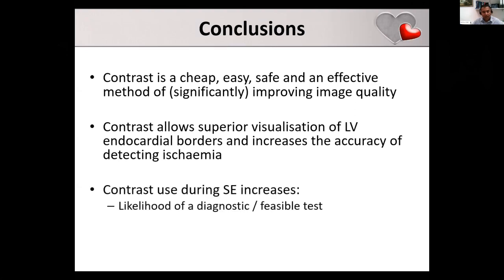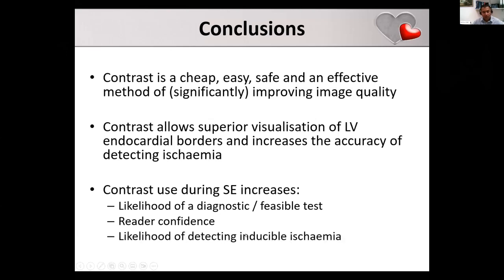And like I say, we know that if you give contrast, the chances that you will get diagnostic images are much higher, the chances that you will be confident in your images is much higher, and the chances that you'll detect an abnormality are much higher. Okay, thank you very much.